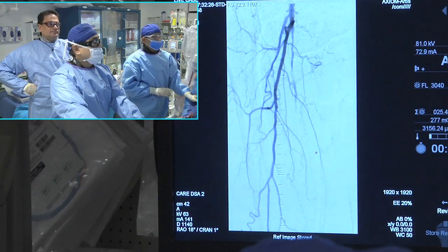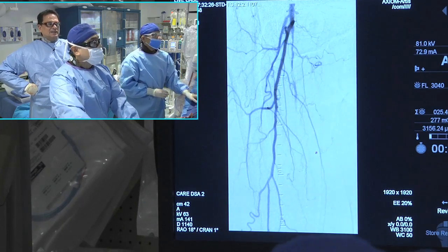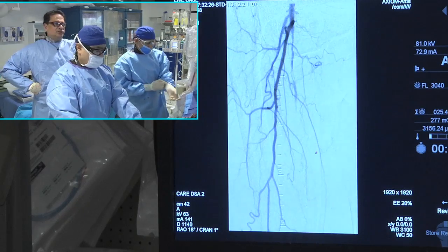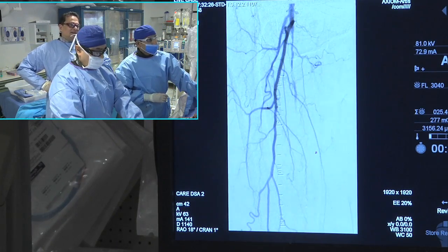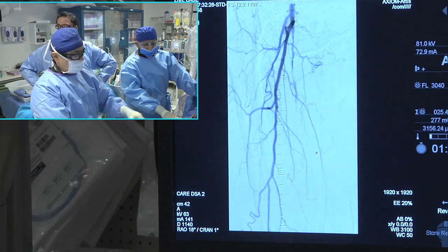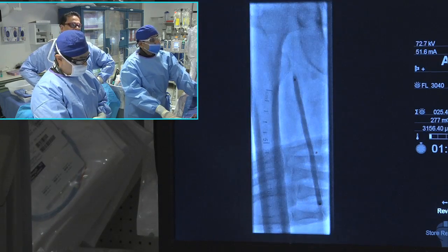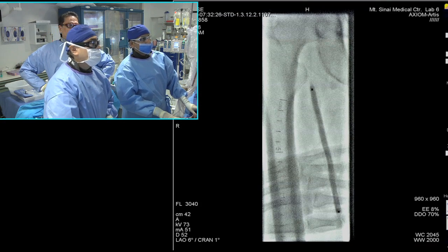Oh, great. So right now, what Dr. Jain is doing is looking at the ostium to see where he should end the balloon, and I think he's going to end it just shy of the ostium. And you know, the problem with the DCB is it's painful, like the lady's having pain, but you do have to have a minimum of a 3-minute inflation. So it's where you need really good nursing, like Elizabeth, and just basically giving her meds and letting her be calm.